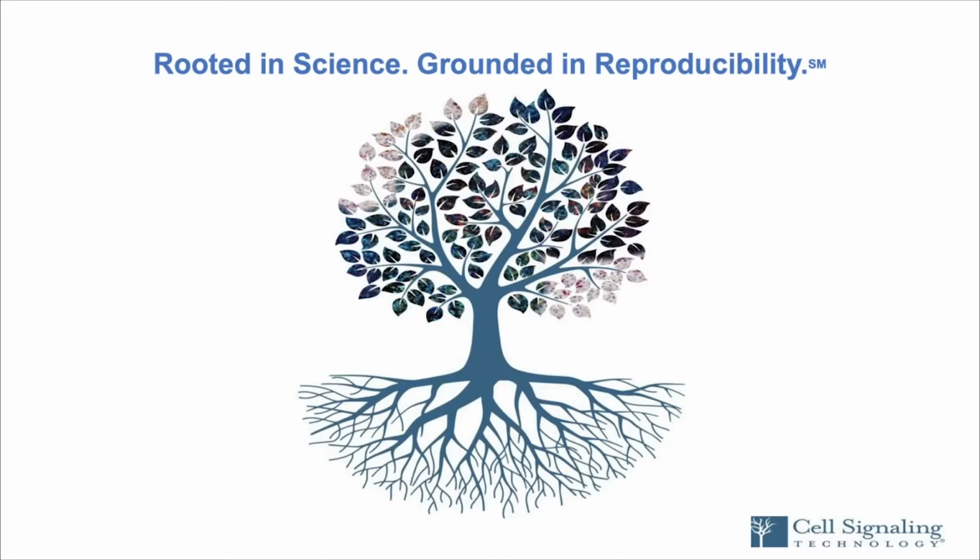We have a pretty well vetted system we go through, wherein we'll often start with cell pellets, either transfected cell pellets or an endogenous plus minus model. And that's our first pass to whittle down all of our clones to the best ones.